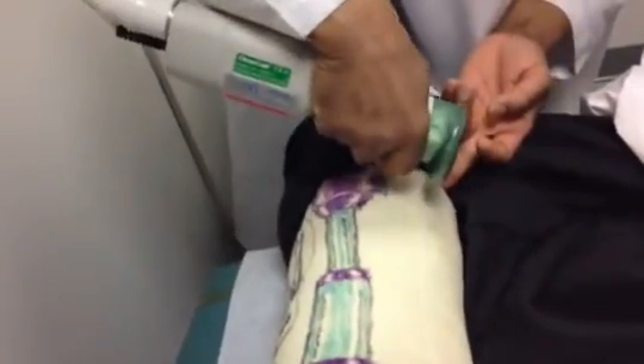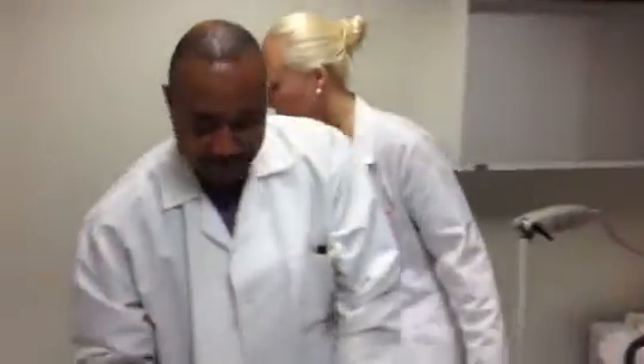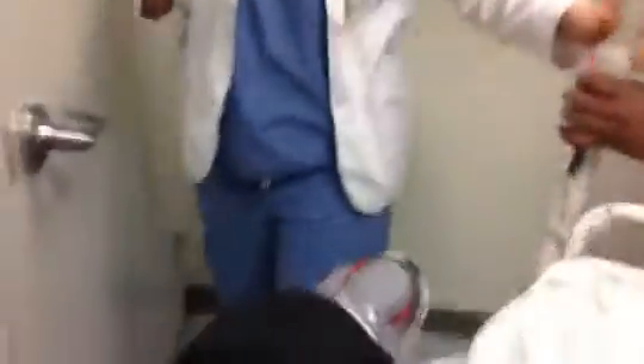You can also start from like this. You can hear the break. You can go down, come up, go down, come up. I can tell you I'm going to go that way too. Come around here. Can you turn all the way over? Thank you. Now try to bring your hand up a little bit more so you can get better feel.